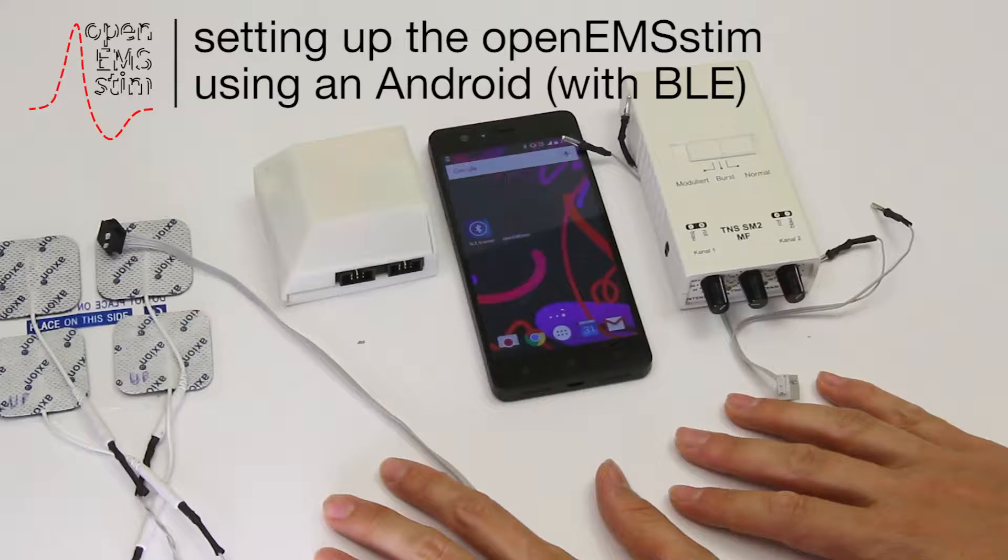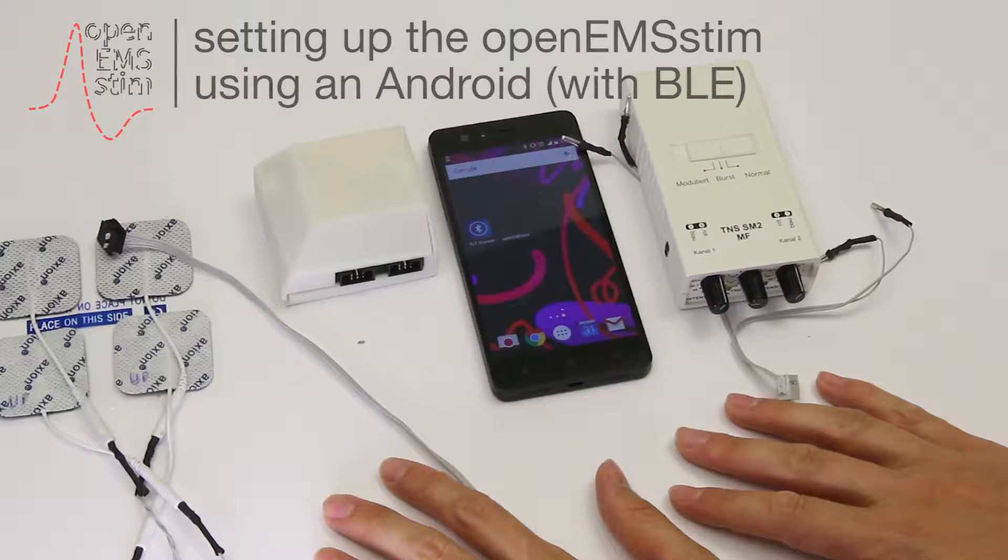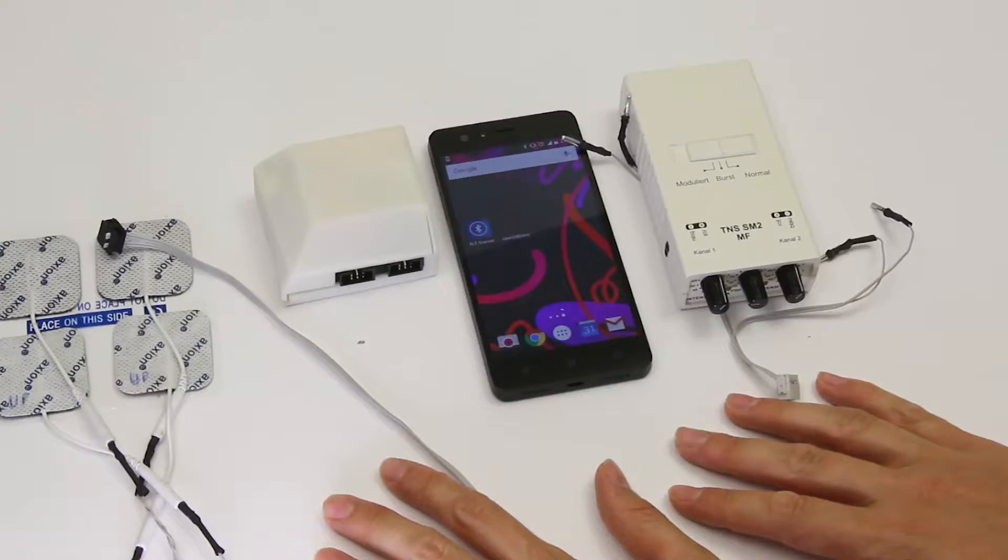In this tutorial I'll teach you how to set up the OpenSTIM board using an Android device with Bluetooth low energy.